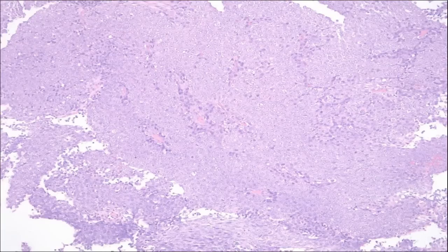So in terms of what we see here, actually a little bit similar to the last case, another undifferentiated malignant tumor. Maybe in this one the cells look a little bit bigger, but we have a sheet of cells, we have some vessels, but you'd have a very broad differential diagnosis for this.